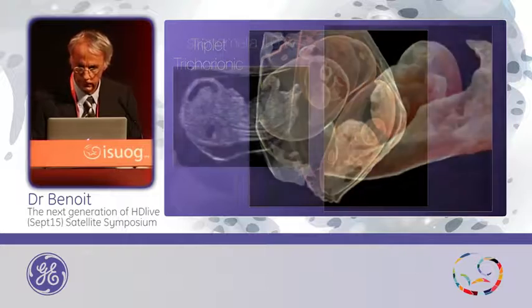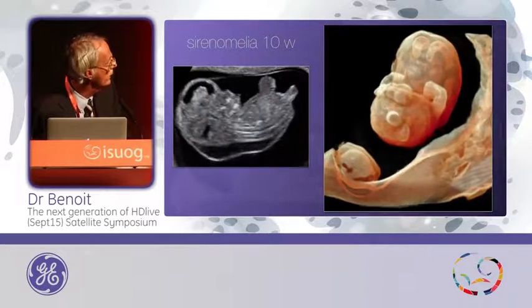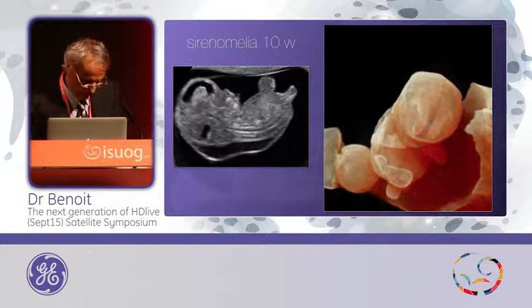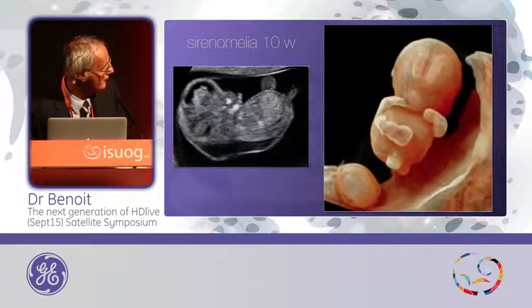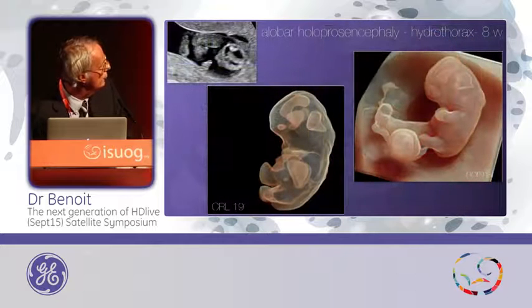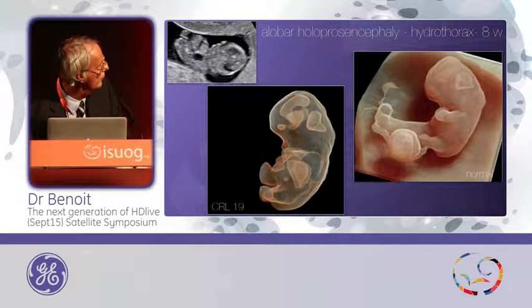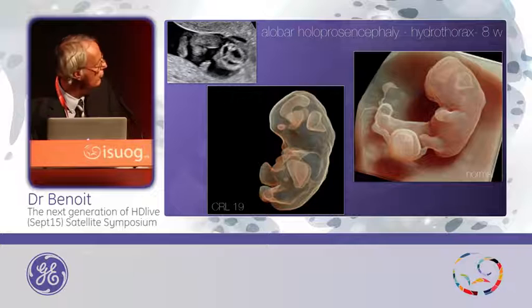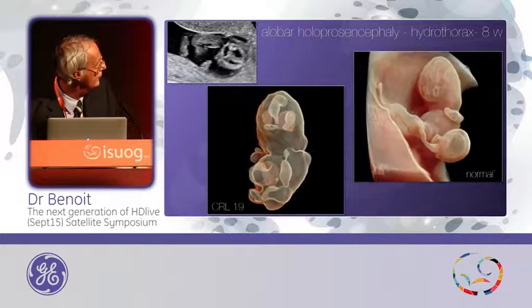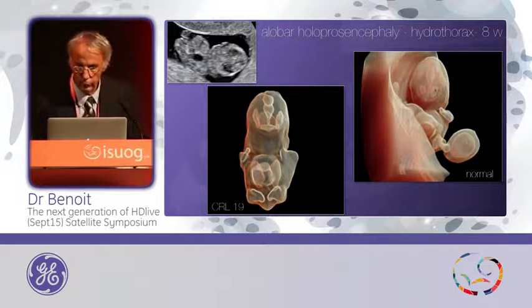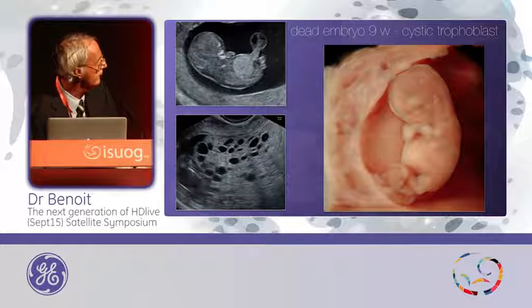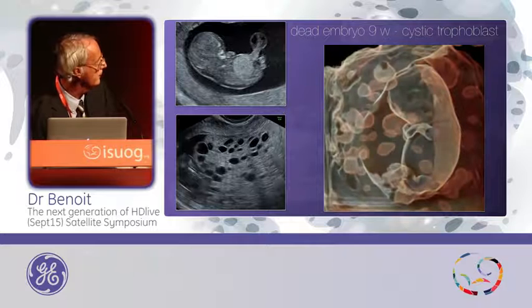Some examples in cases of malformation. This was a case of sirenomelia at ten weeks of pregnancy — the brain was normal, but also with club feet, club hand, and only one leg, and this is a part of the tail. Alobar holoprosencephaly at eight weeks of pregnancy: this is a normal one, and this is this case — a single frontal ventricle compared to the two normal lateral ventricles. This was a dead embryo at nine weeks with a cystic trophoblast — we increase the silhouette and you can see all the cystic parts within the trophoblast.